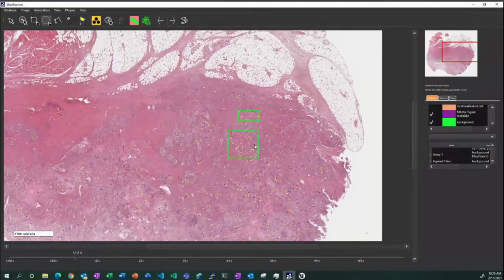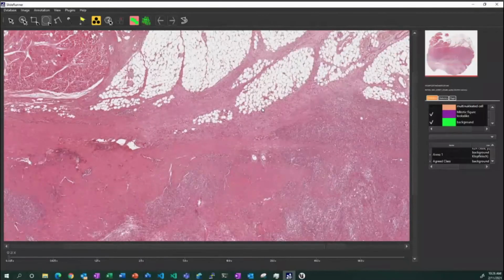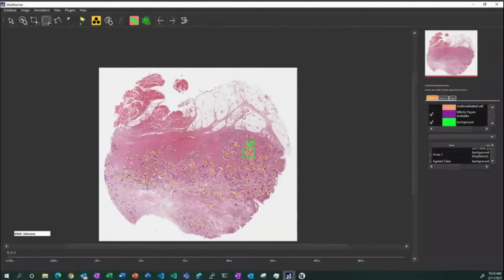Both do diagnostic work. So the pathologist is scanning over this entire slide, and they've spent years practicing. They do it very rapidly, and they know that certain types of tissue within this specimen are likely to have mitotic activity.